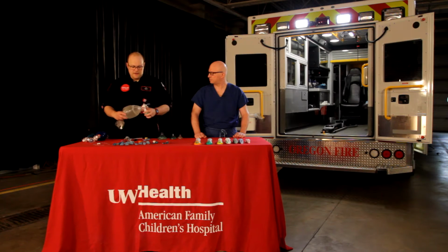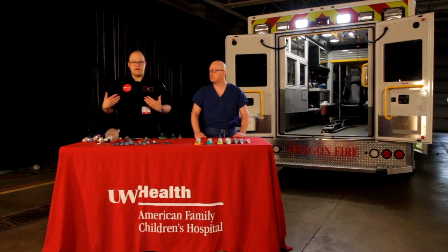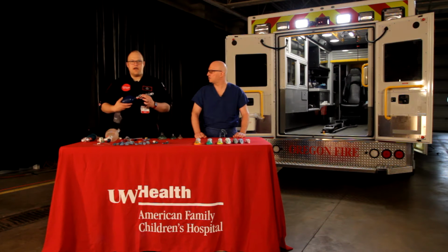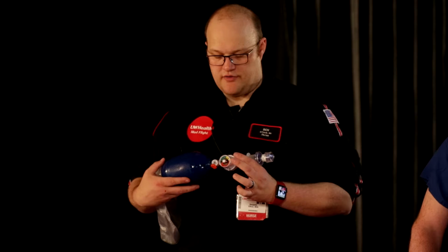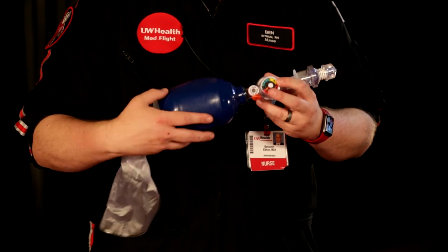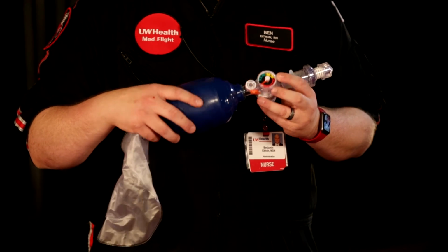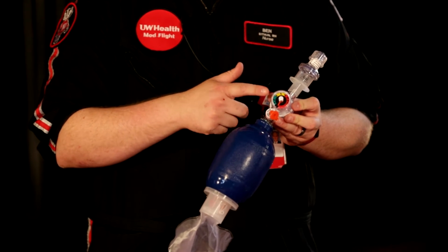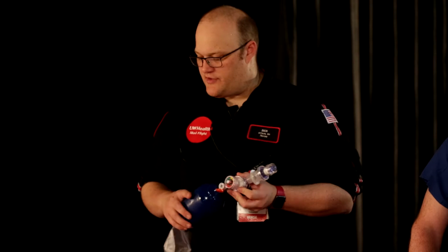The other thing to keep in mind is if you have a valve, because sometimes, as you said, Jonathan, it's very concerning when you have a child that's in danger, and the knee-jerk reaction is to bag very hard and very fast, and you don't want to do trauma because kids have very small lungs. Many of the bags come pre-installed with these dials next to the valve, and so it'll tell you how much pressure you're giving. They make these for adults as well, but more often than not, I see them on pediatric-sized bags. So if you have that ability, please use it.